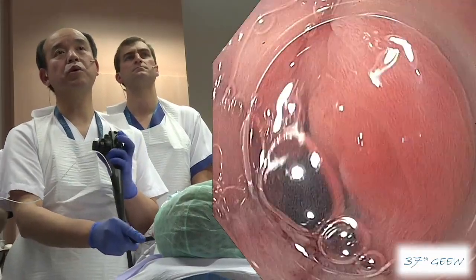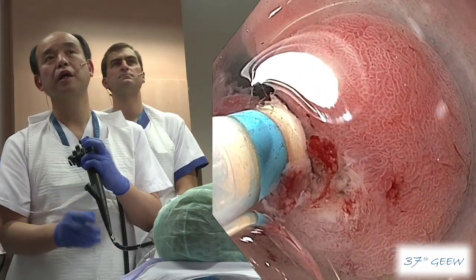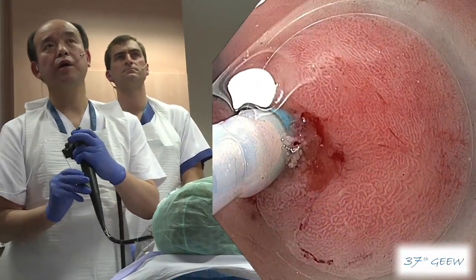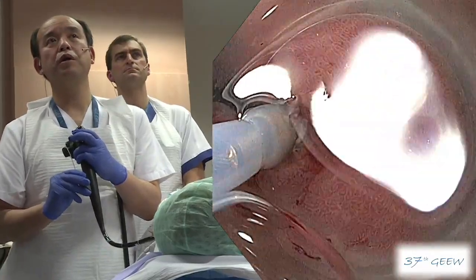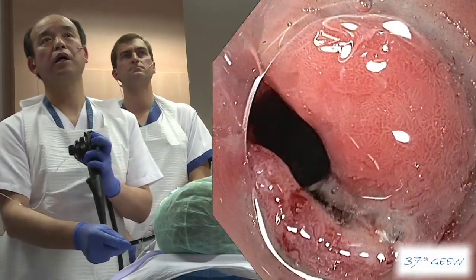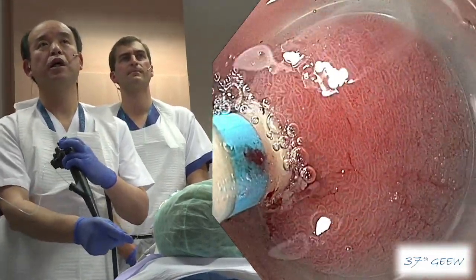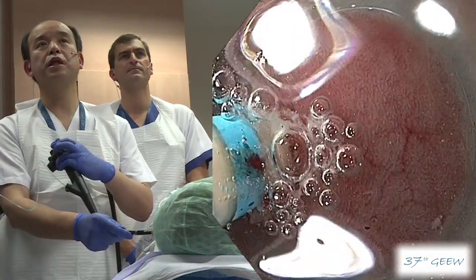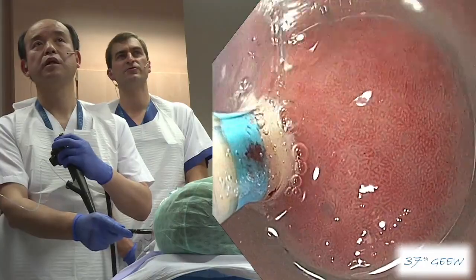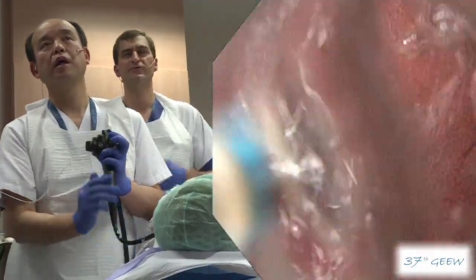Then I extend the mucosal incision from here to the right side. Before that, I will inject a little bit more directly. Catch the edge and make the incision to the right side. As we can see, using near focus during the dissection helps you to have a good focus of the picture — not only for the mucosal pattern, but to look closely at what you are doing.